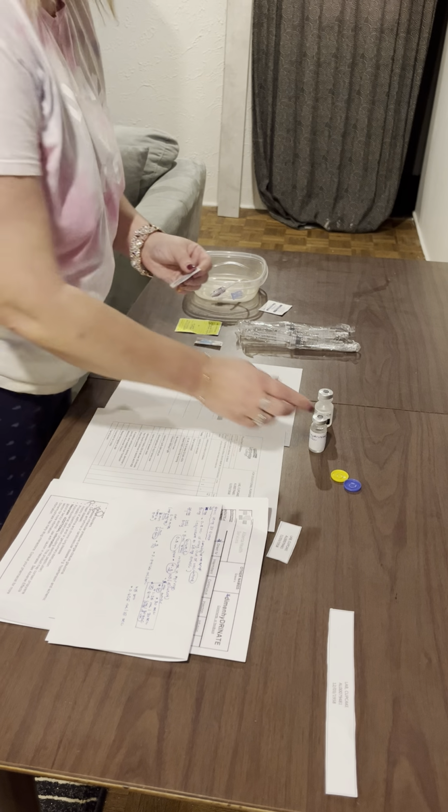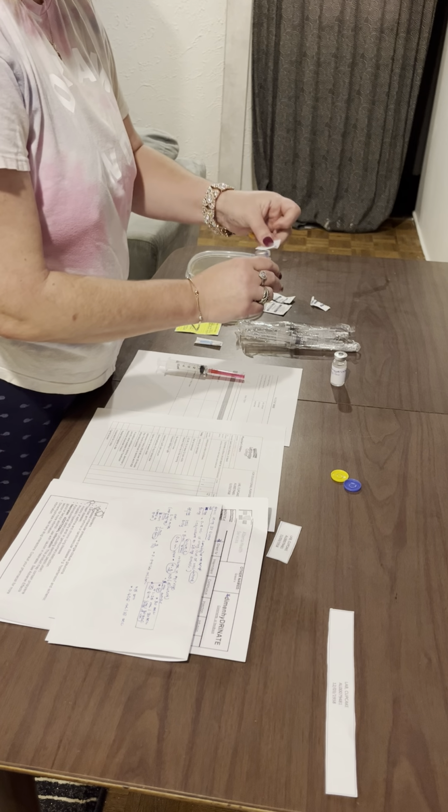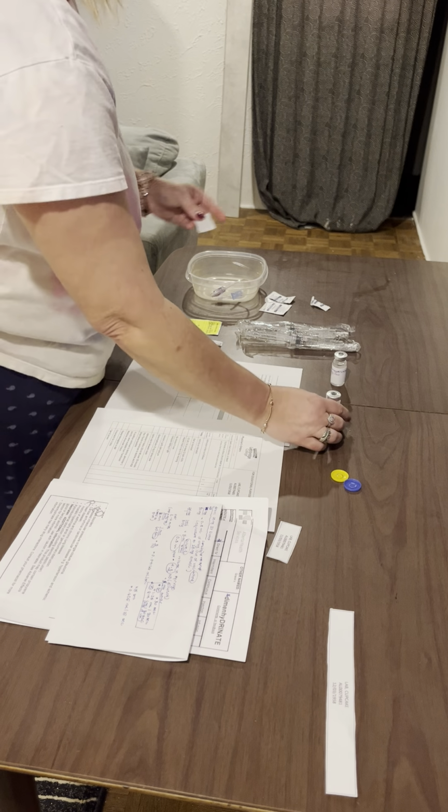And we're just going to give it a swab here. We'll put the Gravol aside. We've already drawn that up. Okay, here we go. Just going to swab this one more time. Let it air dry. Okay, great. And we'll get rid of that.